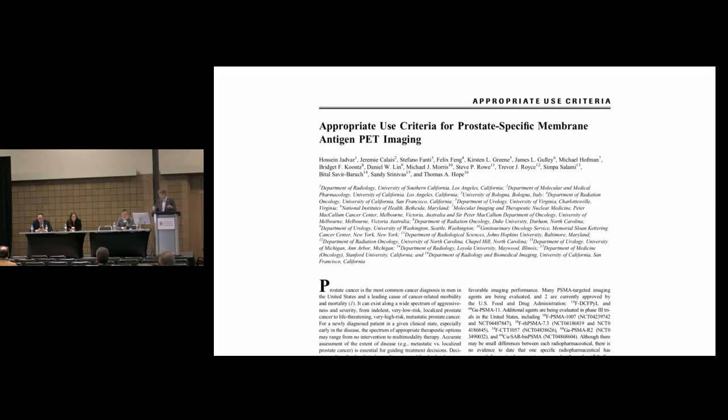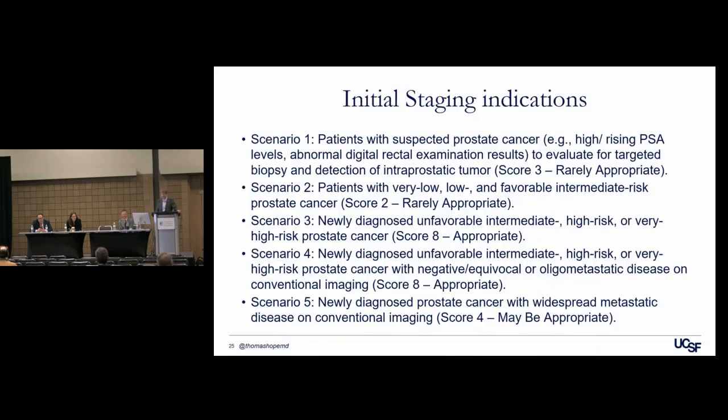which we spent a lot of time making for PSMA PET, and I find this document helpful to follow through because obviously I wrote it, therefore I think it's really awesome. But no, I think it's helpful to think about it in the way this document is. So the initial staging indications. So we listed 5 different indications for initial staging.